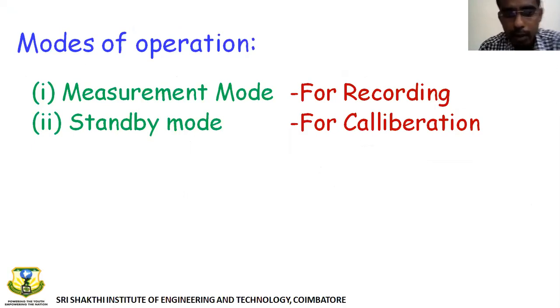What about servicing? Calibration is nothing but servicing this equipment then and there. Whenever there is a measurement, there is something called benchmarking, meaning we have a reference scale and we need to see that our plotting falls into that benchmark scale. That is what we call calibration.